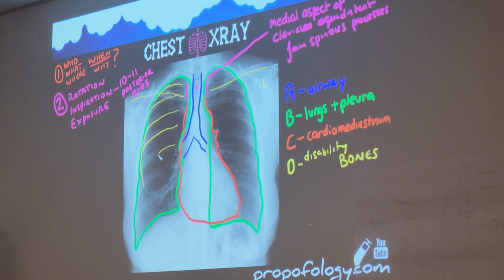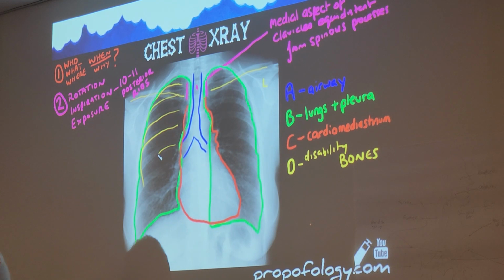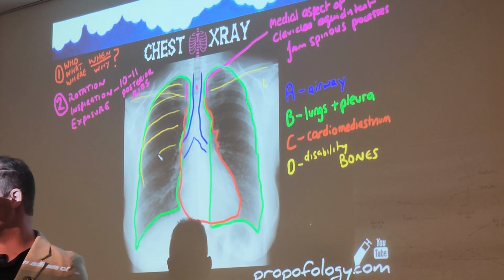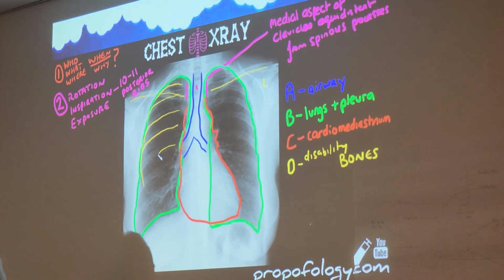And what else is the important anatomy, guys? You should know it like the back of your hand by now. What's the important anatomy of those lungs? What else we got? Costophrenic angles. Costophrenic angles, left and right. What else? Base. What else? Apices. Apices, correct. And ribs. Ribs, of course, we're going to come back to ribs later on the review, but yes.